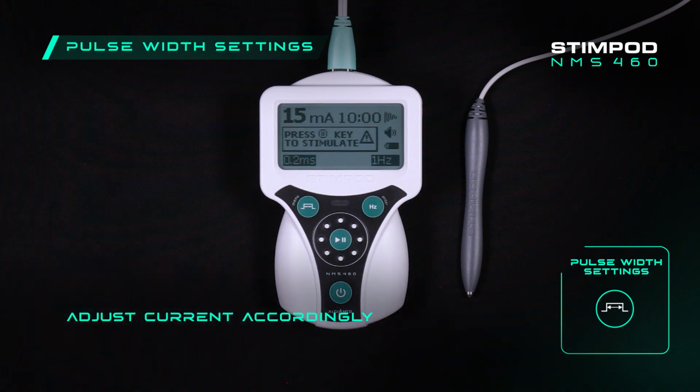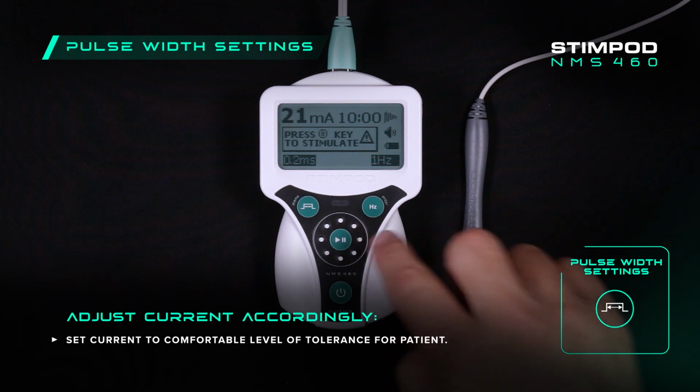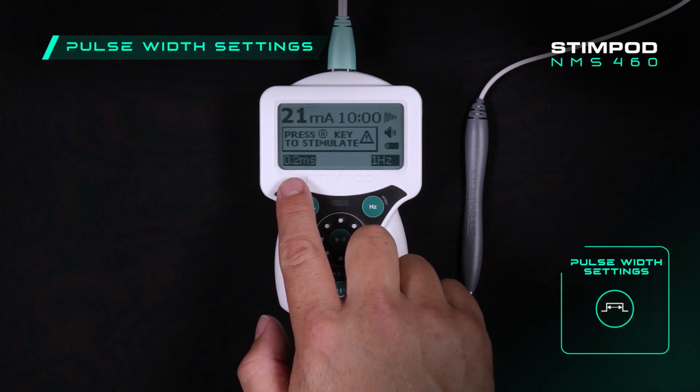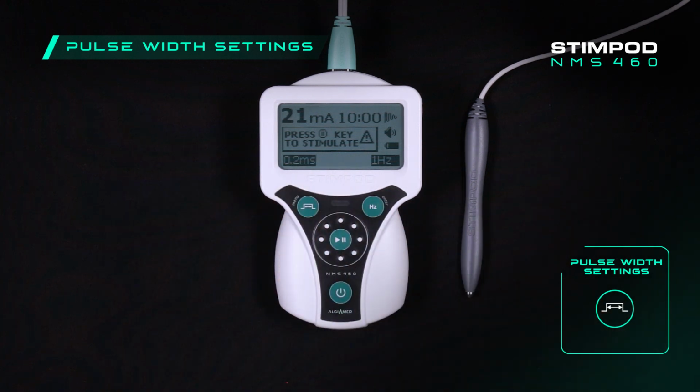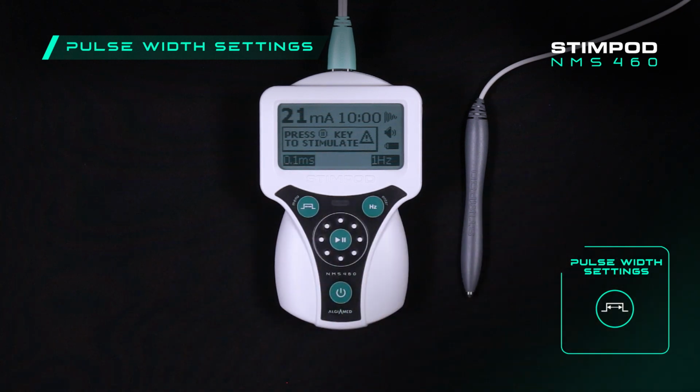From here, you can continue to increase the current to a level that the patient can comfortably tolerate for the duration of the treatment. Most practitioners prefer to always use the Stimpod on the 0.2 millisecond pulse width setting and only revert to the 0.1 millisecond setting with patients who are particularly sensitive to the stimulation. Both of these settings can be enabled or disabled in the system menu.